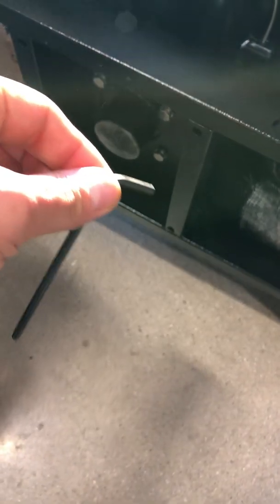Now what we're gonna use is the 4 millimeter Allen, to open up the screws that are located right over here where the pedal goes. You're gonna have 1 screw on the right hand side and another one located on the left hand side. So now we're gonna go ahead and loosen it up. After loosening one side, we're gonna move to the other. And once it's really loose, we'll be able to take off the pedal.